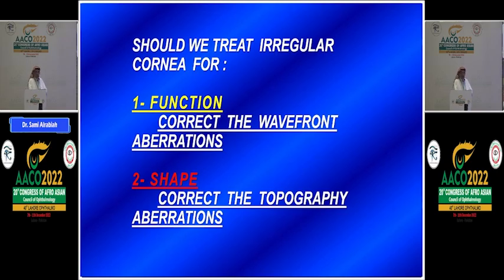Now, are we going to treat the function or the shape of the cornea? If you are going to treat the function, you go for wavefront, and we will talk about it. If you are going to treat the shape, you are not happy with the shape, you go for topography guided. And with topography guided, we don't say wavefront topography guided. We say topography guided customization.